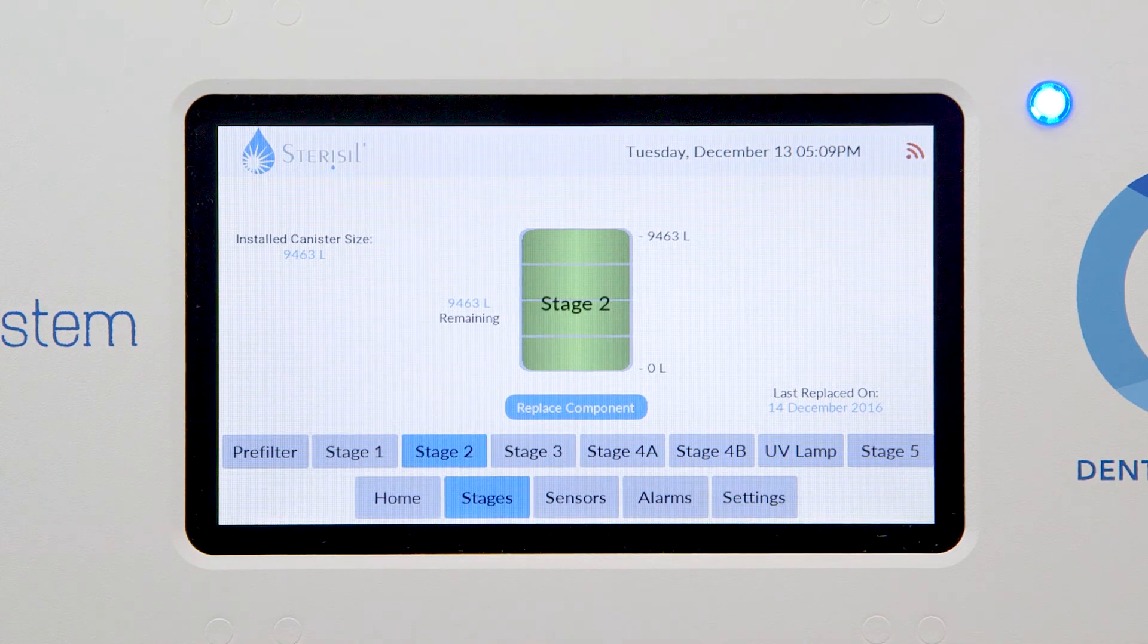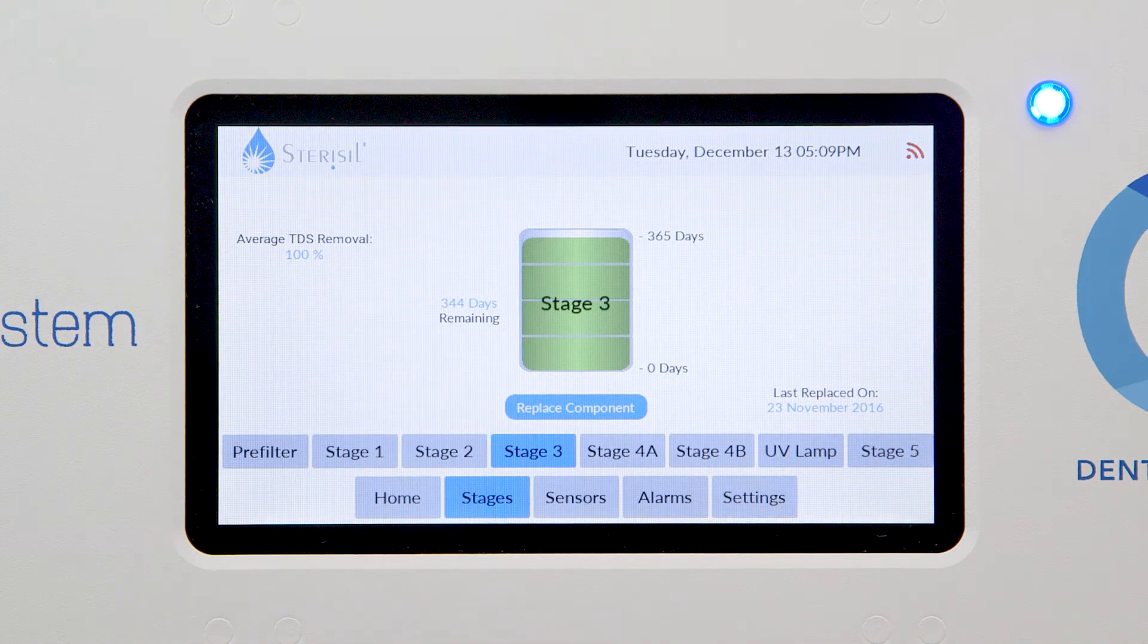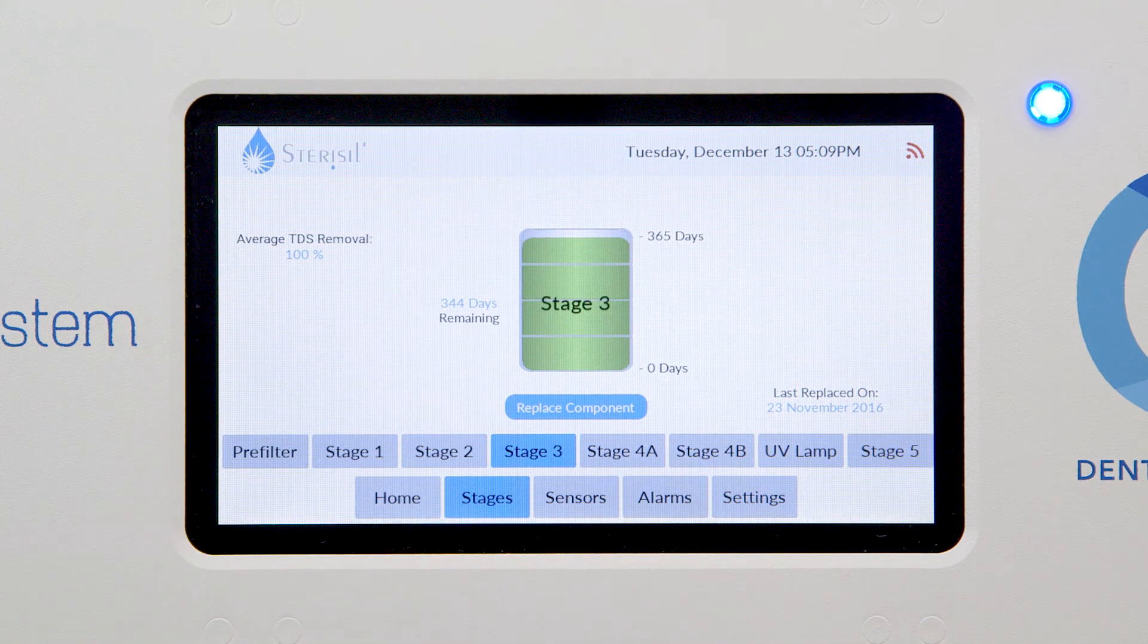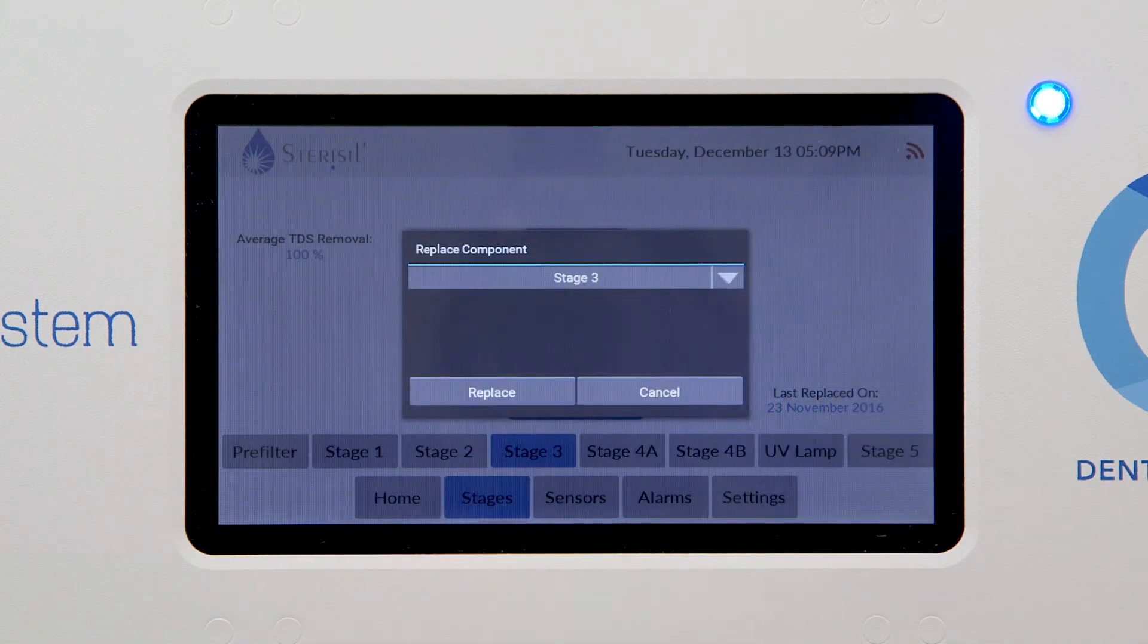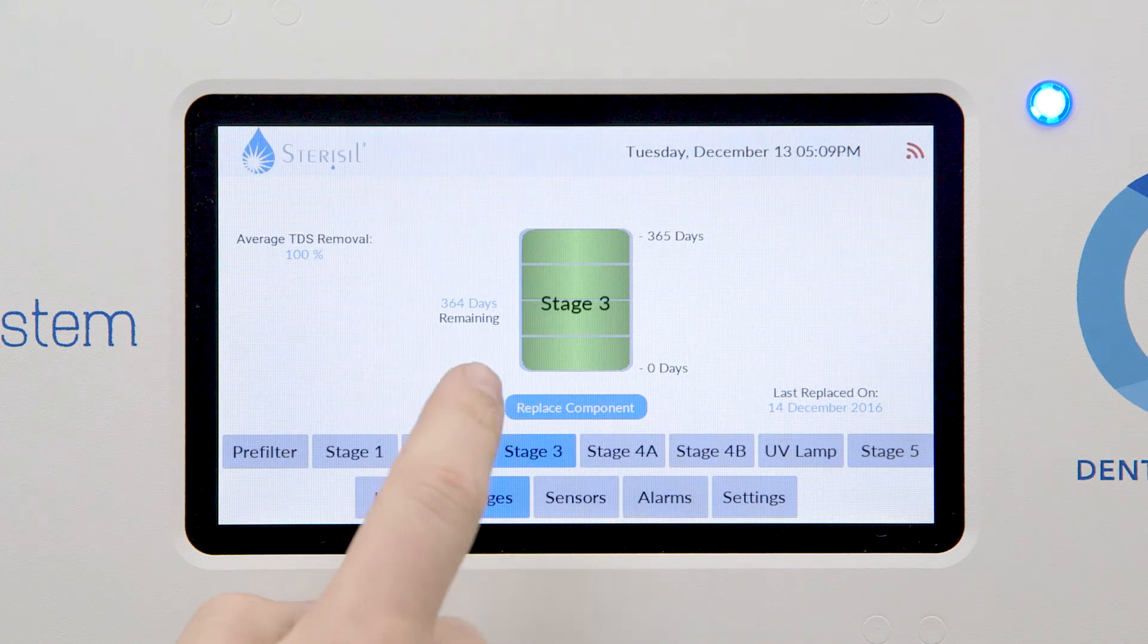Stage 3's lifespan is based on either a 364-day count or the TDS water quality coming off it. If the counter on Stage 3 is not reading 364 days, select Replace Component, then touch Stage 3 from the drop-down menu and touch Replace.